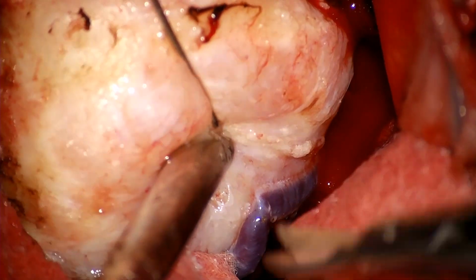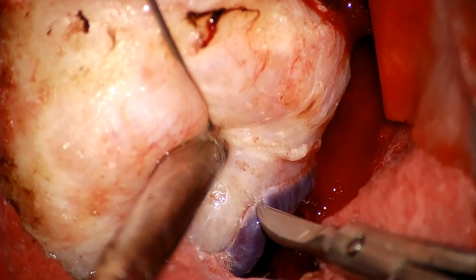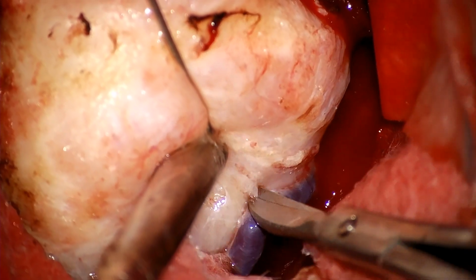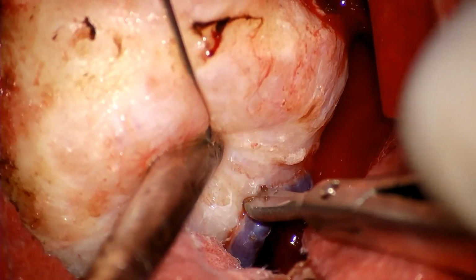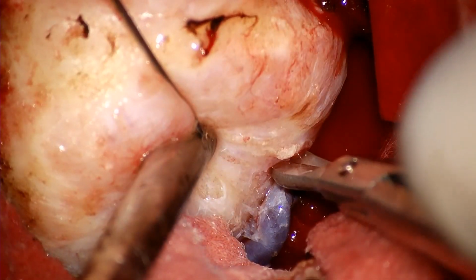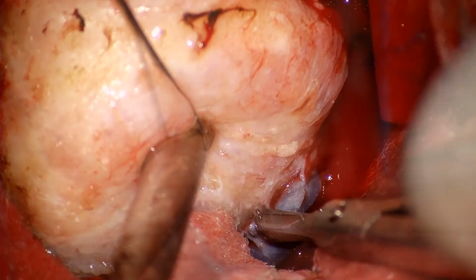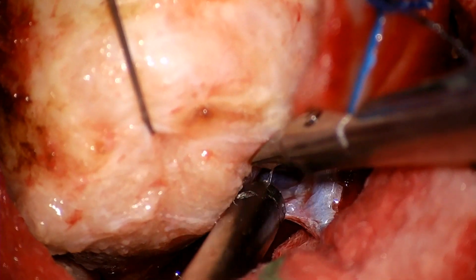As you can see here, we use a nerve hook for the assistant to retract the tumor slightly, but note that sharp dissection is needed to preserve the Sylvian vein. See how I grasp the arachnoid with the scissors and apply traction towards the vein, and how I use the scissor closed as a sharp dissector to aid with the peeling.